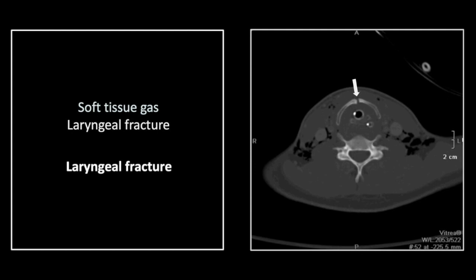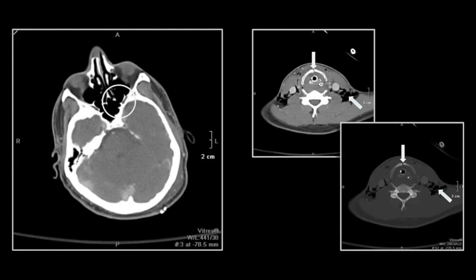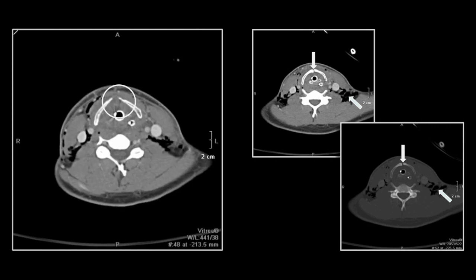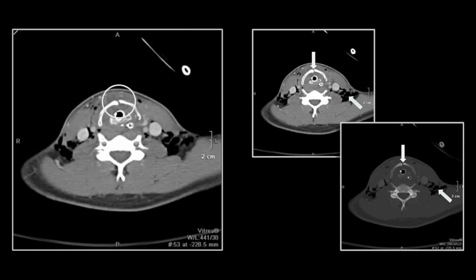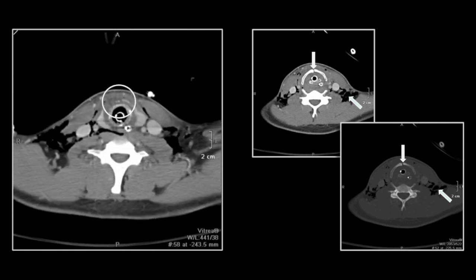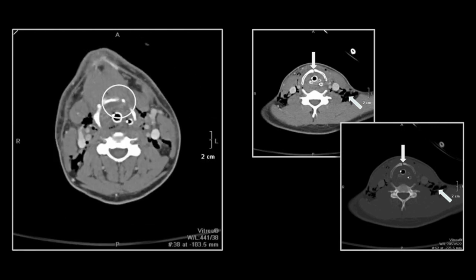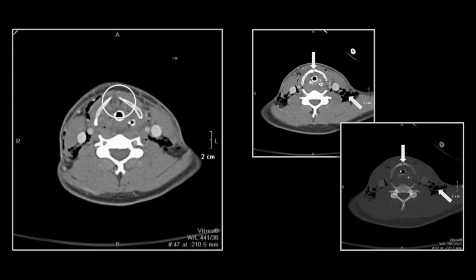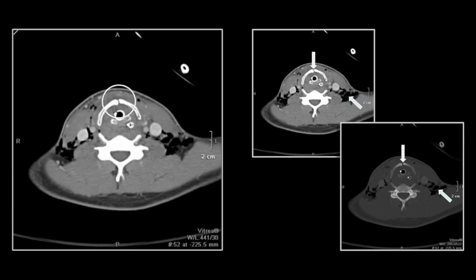This is obviously an acute injury. There is the hyoid bone, and there is the midline defect in the laryngeal cartilage.